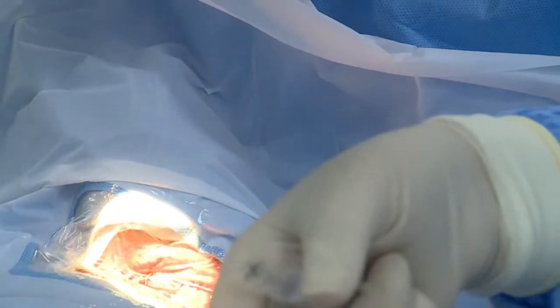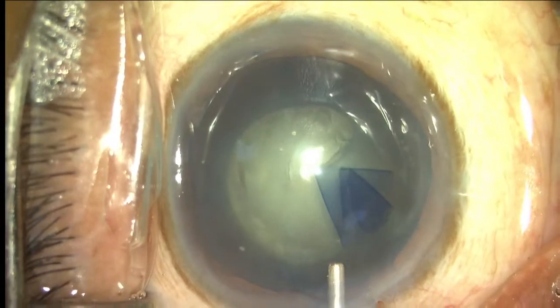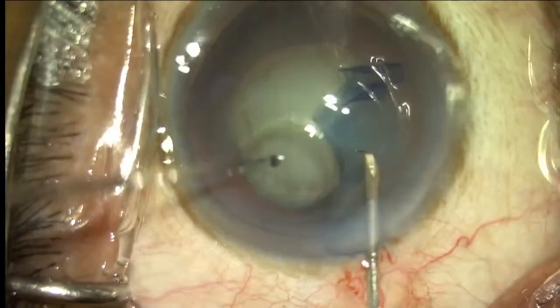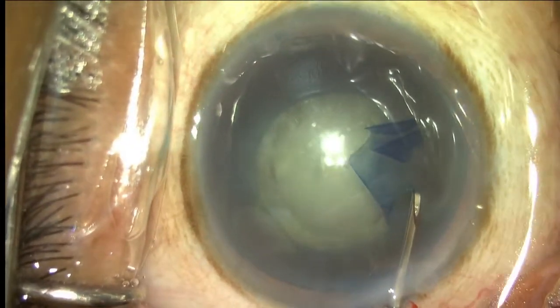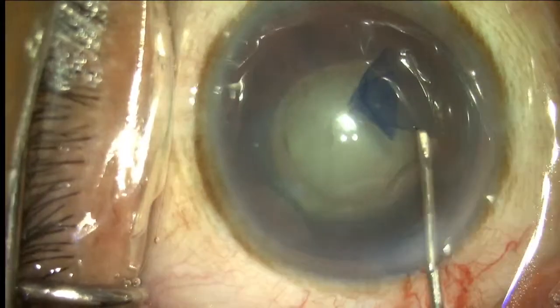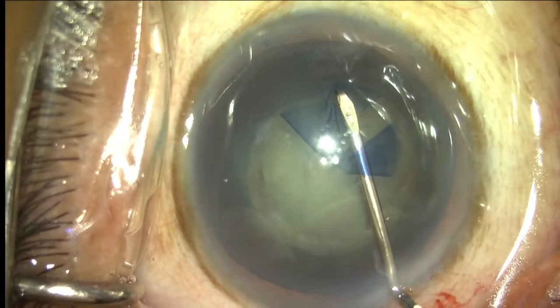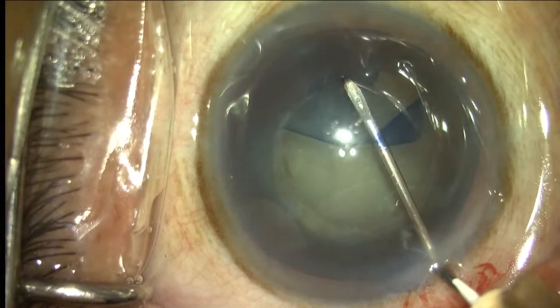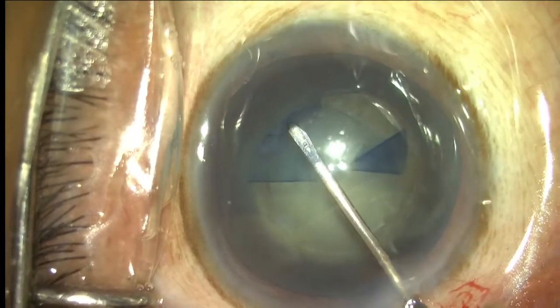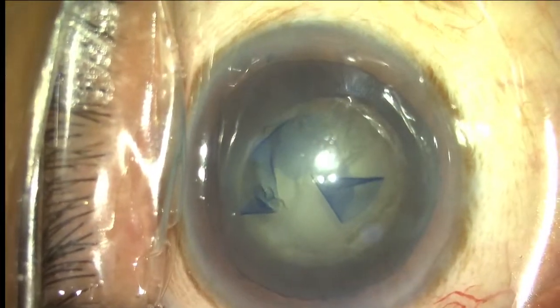Visco, please. It's looking a little dense, scattered in the center. So I'm trying not to make a very big rexis. Trying to keep it as round as possible. Okay, so I think it's a decent size.